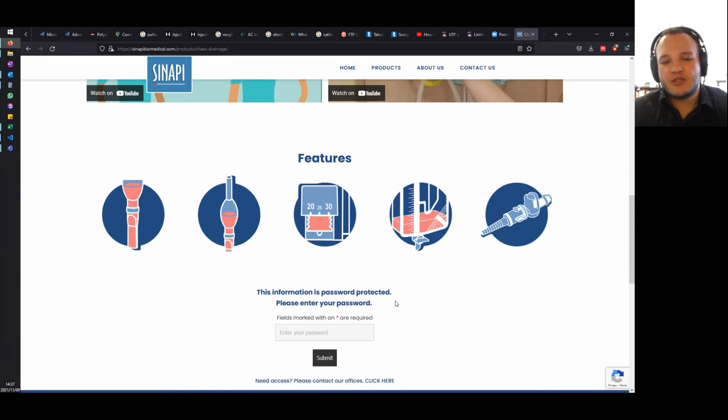It actually gave us quite insightful information because it confirmed some of the things we already knew, as well as showing us potential drawbacks that could come from the design, and from these drawbacks obviously we could then develop it further.